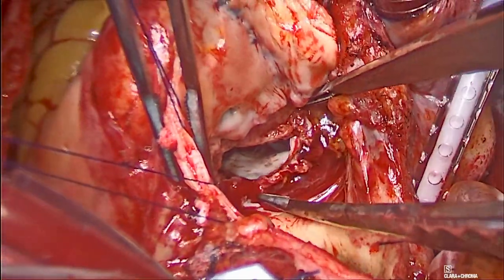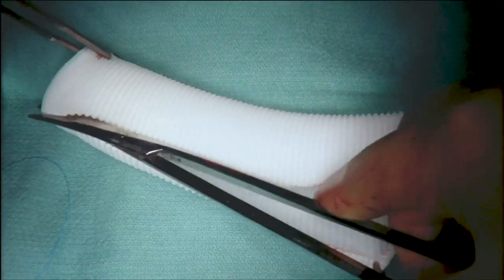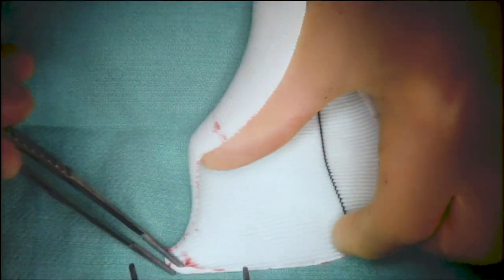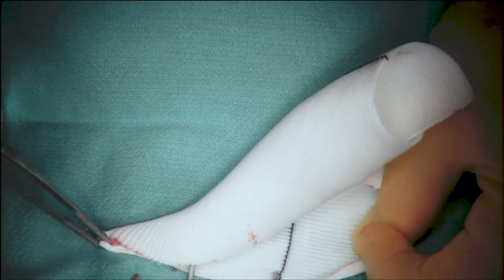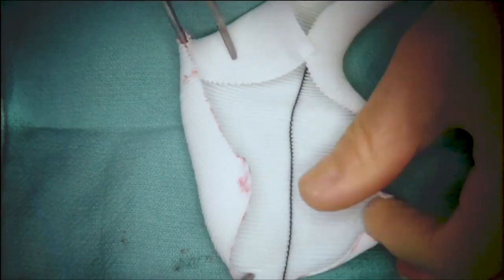The distance of enlargement was measured, and we used a Dacron graft as a patch. An appropriate size patch was determined and fashioned accordingly.